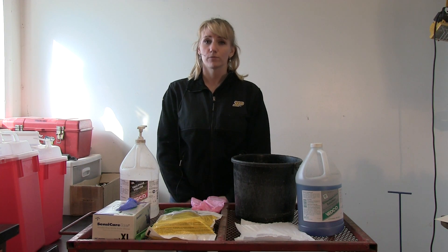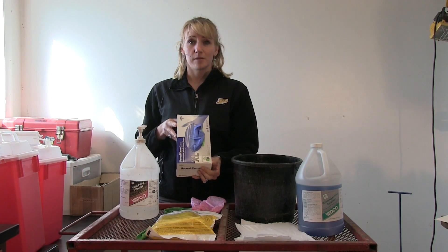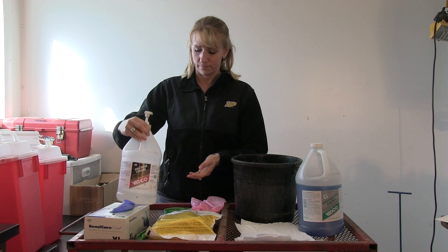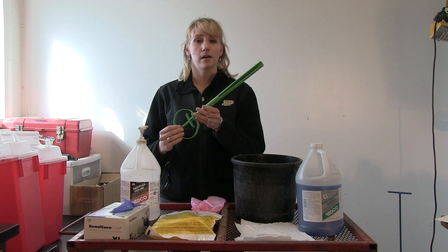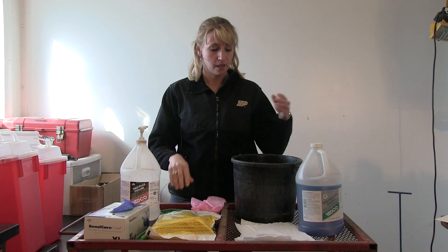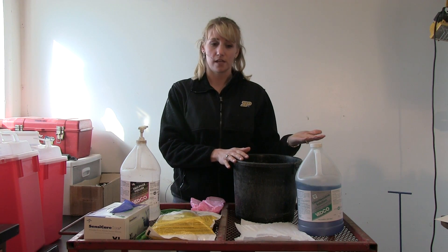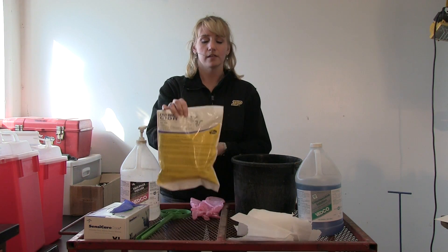I'd like to discuss the equipment you will need in order to insert a CIDR into a cow. First, you will require some examination gloves. You will also require a general lubricant — preferably non-spermicidal. You will also need a CIDR applicator, which can be provided by Zoetis, formerly Pfizer Animal Health, who produces the CIDR products. You'll also need a bucket of water with a mild disinfectant, diluted according to the manufacturer's instructions. Common disinfectants are Novasan and Ephrosan. You will also need paper towels to clean behind the cow, and then the CIDR device itself.